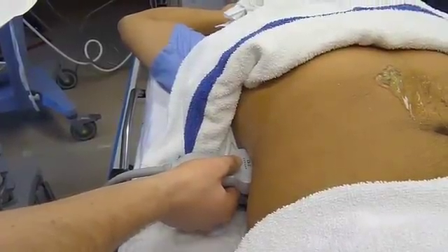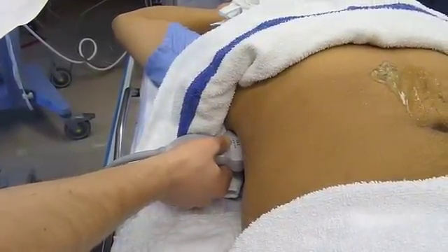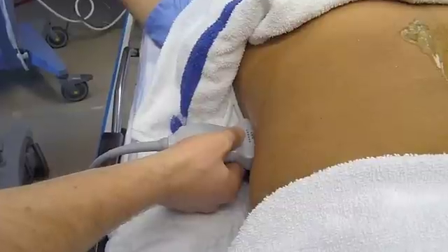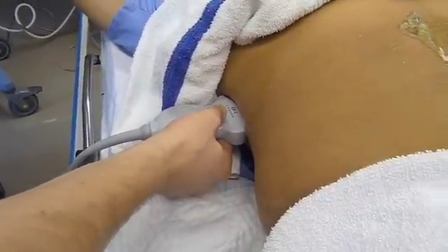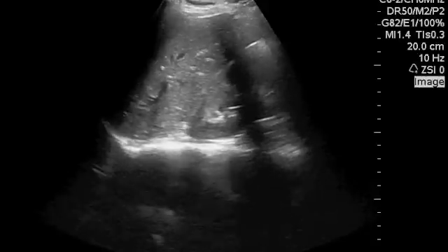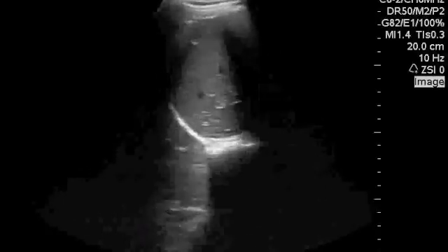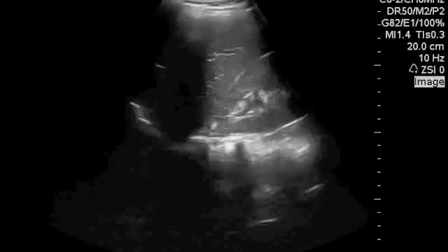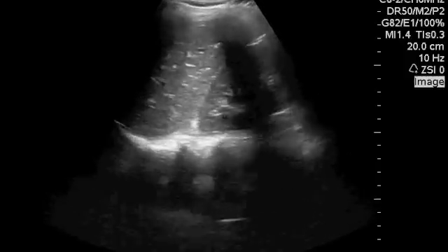Our second movement is to move the probe in the longitudinal direction, while not changing its AP position at all. The goal here is to see the hepatorenal interface. On the screen, you see as I move towards the head, I get a better view of the diaphragm. And as I move down towards the feet, I see the interface — and there's the tip of the liver. That's the caudal end of the interface, and we need to see that.